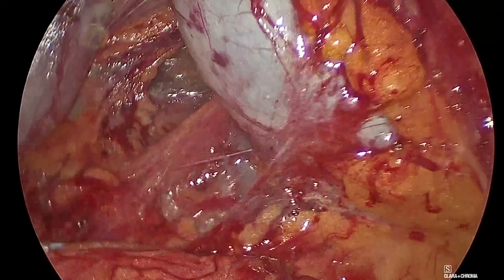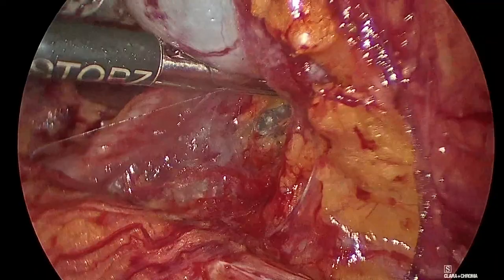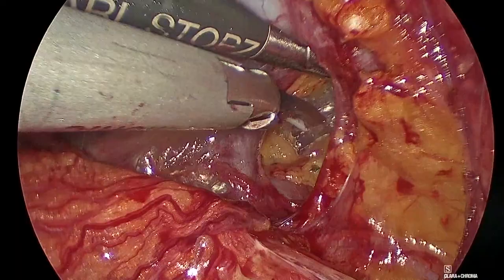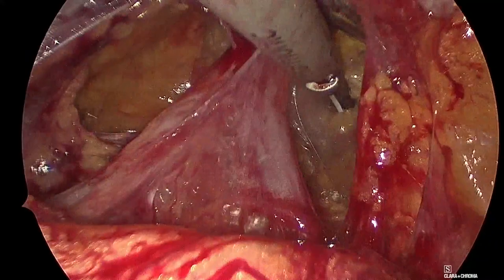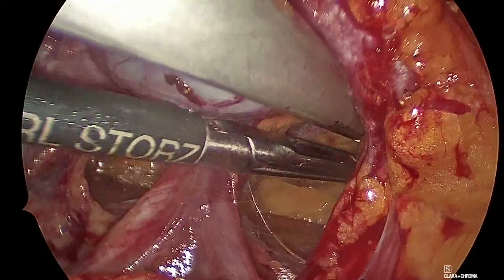So little by little, we'll go. See, there's a vein here and an artery. So let's see what we can do by lifting this up. Luis, tienes que entrarme un poco porque no veo nada. Okay, so here we have an hilum, no doubt. One artery and one vein. And we're marching up.